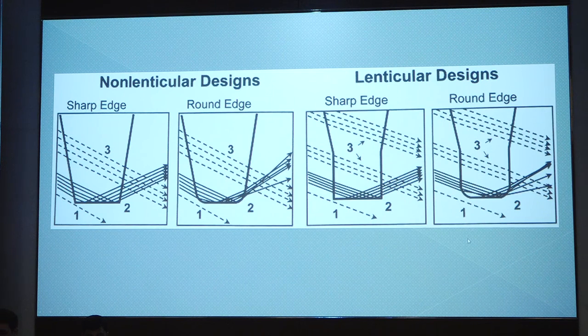Also, present day IOLs have a lenticular edge wherein the thickness in the periphery is reduced when compared to the non-lenticular designs.